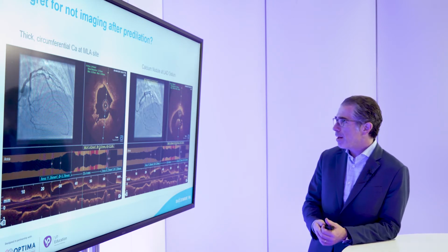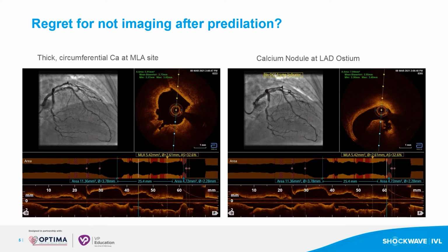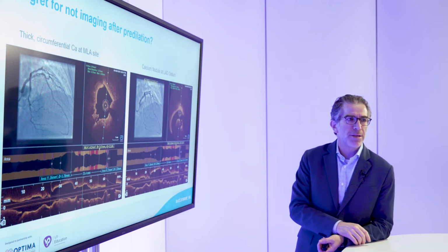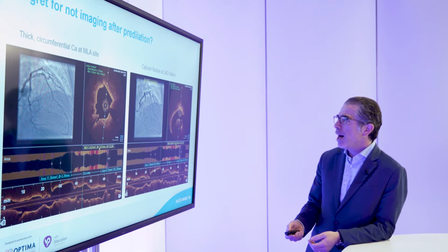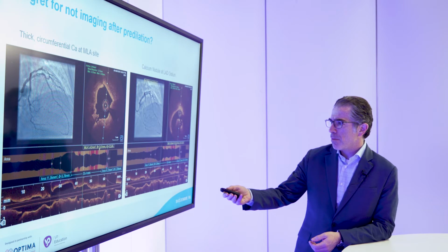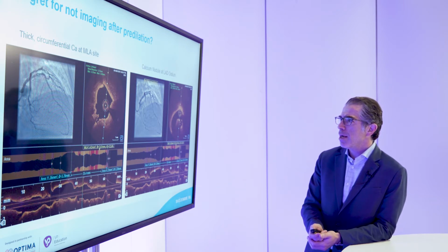And this shows you here, I shockwaved the proximal LAD, and you see that there is indeed a fracture at the edge of the nodule. It shows the therapeutic effect of IVL even in this lesion subset. So I used OCT to determine my DES size and diameter.